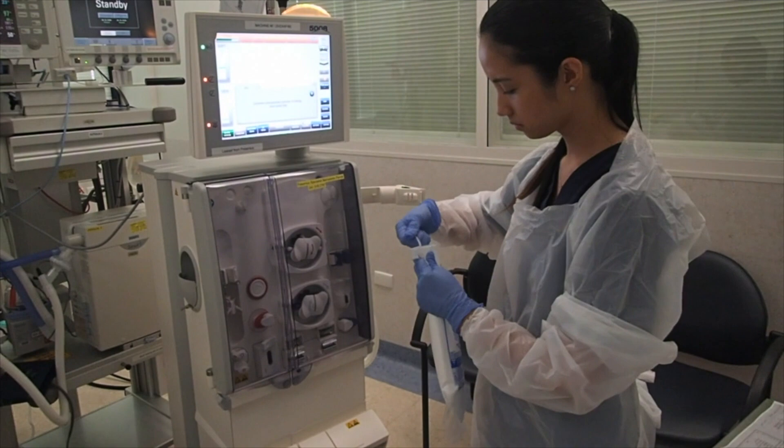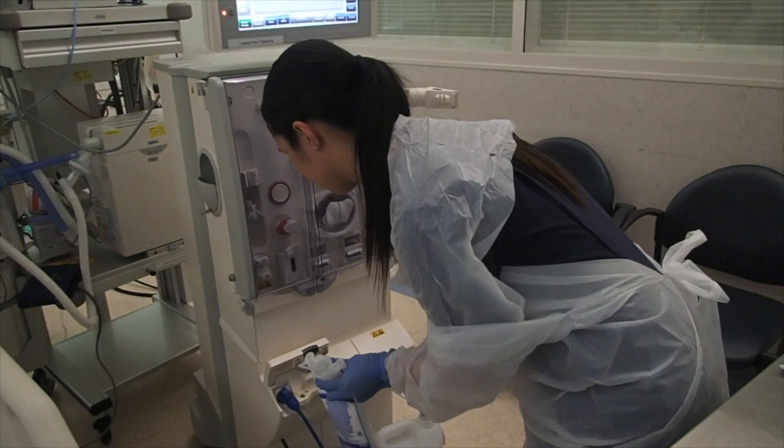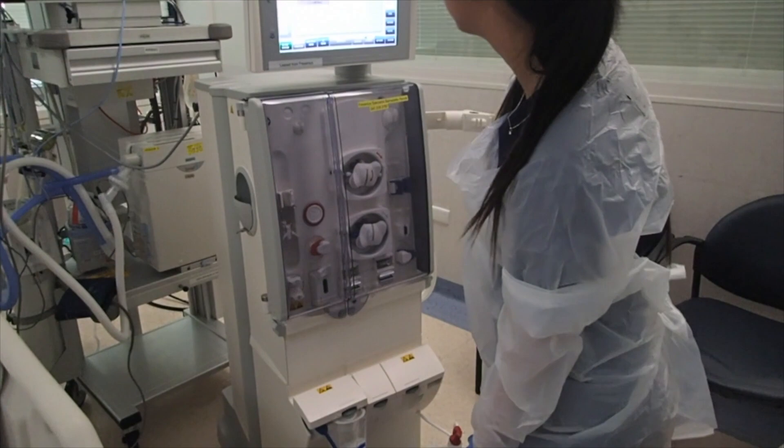You then get the bi-bag, remove the strip on the side, and connect it to the bottom left of the machine by pushing it down and closing the lid afterwards.